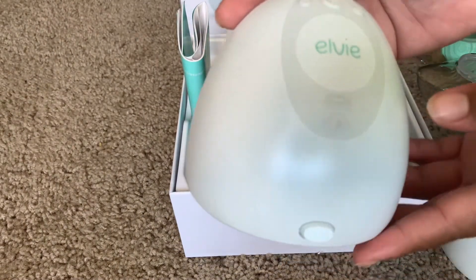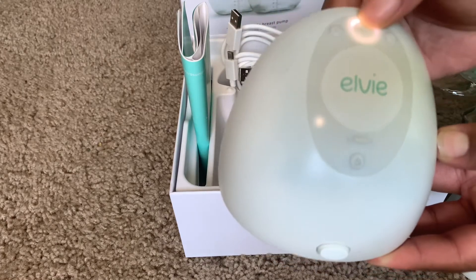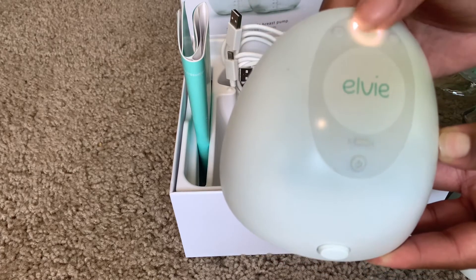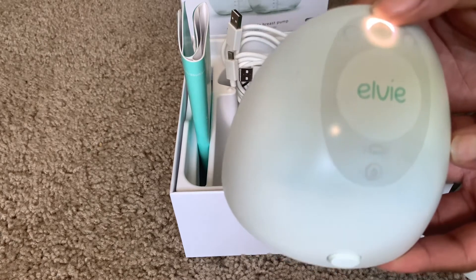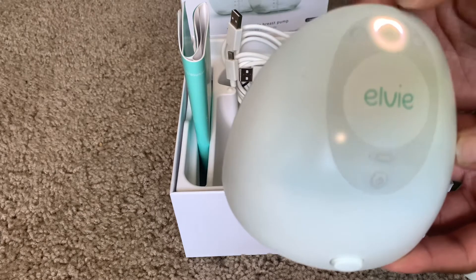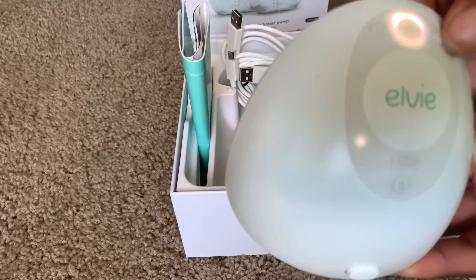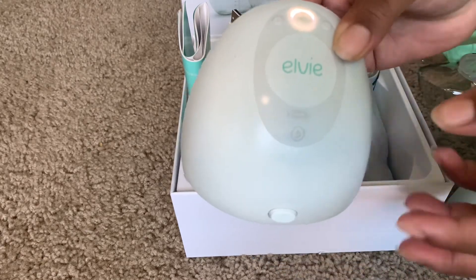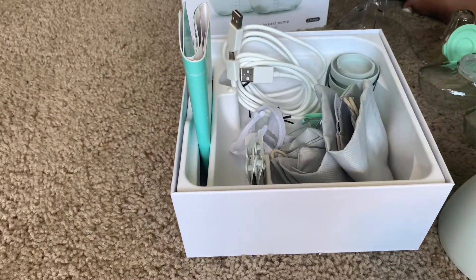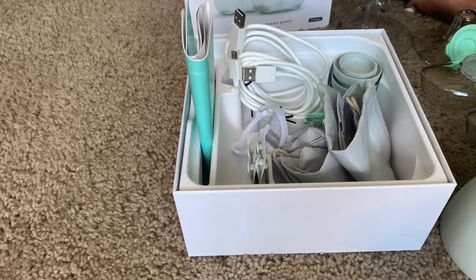The controls are pretty simple — you have your power button and your play button. You press play to start, and the cool thing is it always starts on massage mode. After two minutes it moves into the next mode. You can increase or decrease suction on your breast, and you can also use the app. The Elvie app is actually pretty cool and convenient — that's one of my favorite things about it.